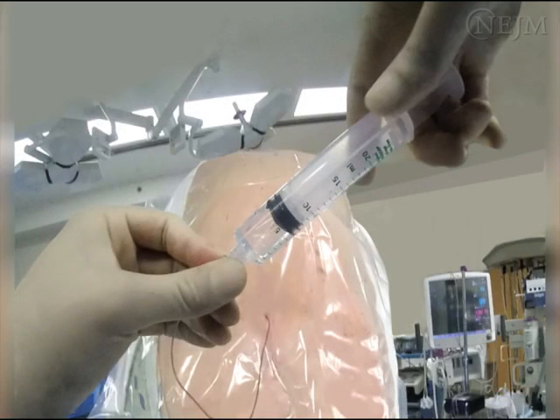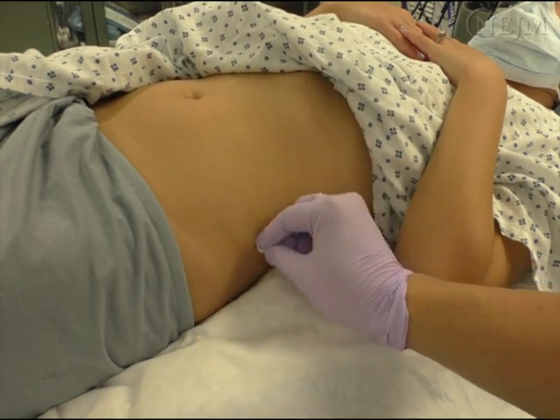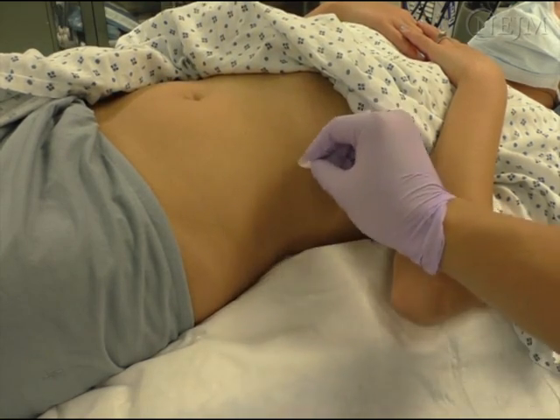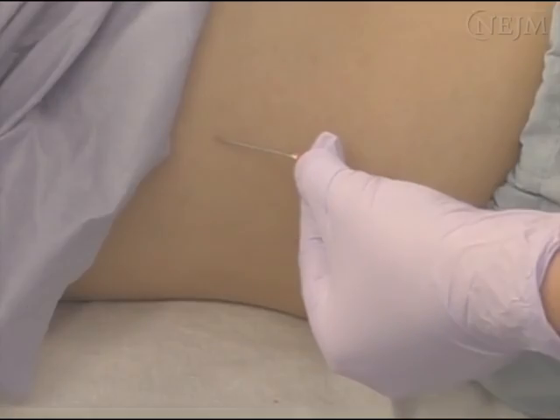Once a local anesthetic has been injected through the catheter, you may test the efficacy of the catheter by testing for changes in sensation. For example, you could use an alcohol prep pad on the skin to test the response to temperature change. Or you could tap against the skin with a blunt needle at various dermatomes to test for nociception.